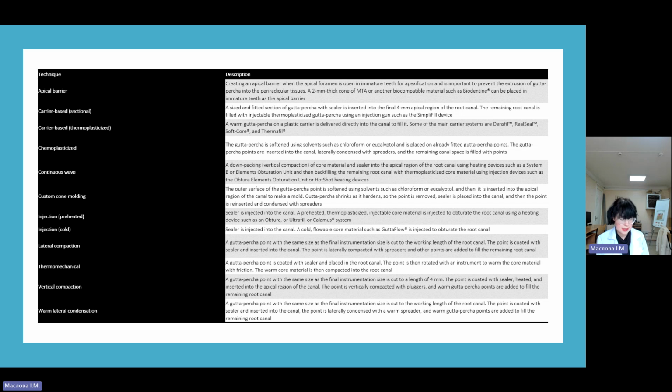Glass ionomer cement exhibits some antimicrobial properties due to fluoride release, low pH values, wet setting, and the presence of ions such as strontium and zinc. An experimental glass ionomer cement-based root canal sealer was developed with an emphasis on enhancing antimicrobial properties.